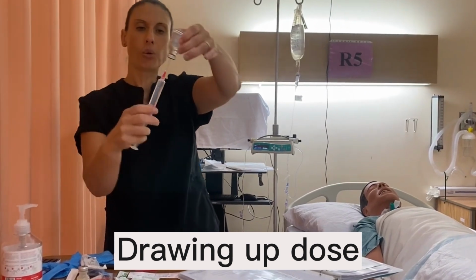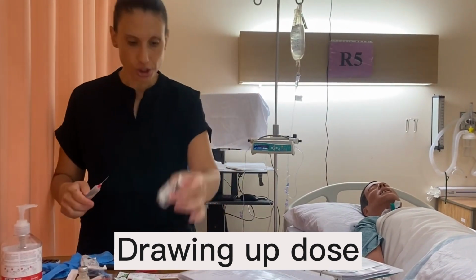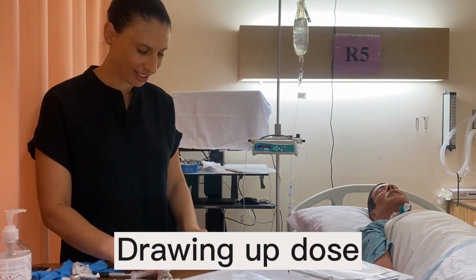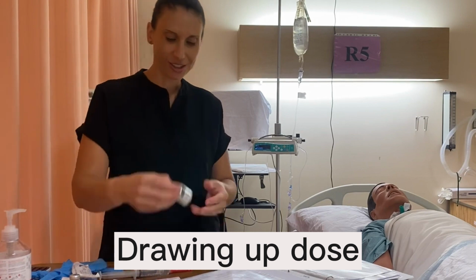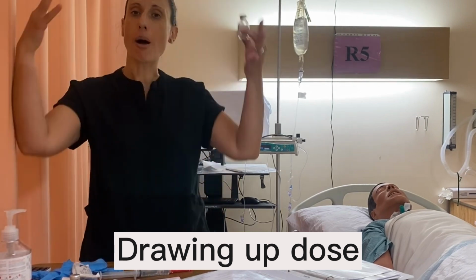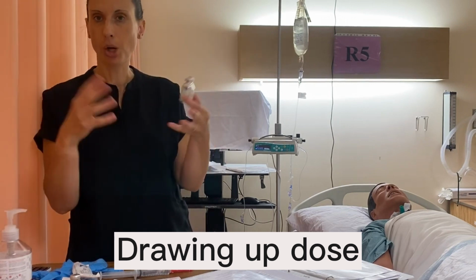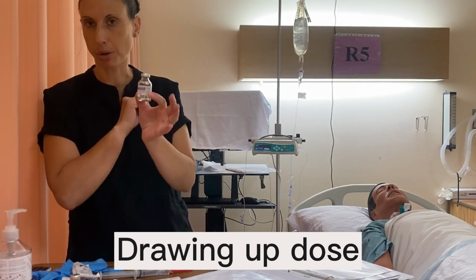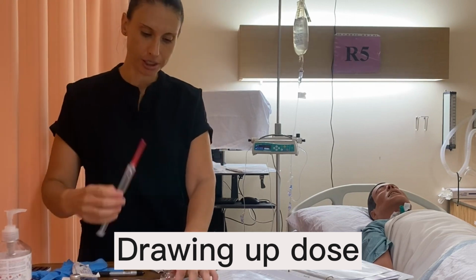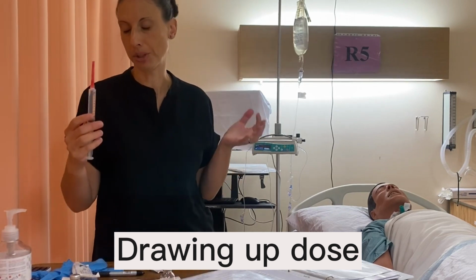Now, one thing about the lab is the medication that is inside here, the powder, is not actually medication. It's a fake powder, okay? It's not like a fake medication. So in clinical, the medication would puff up when it's added with sterile water and normal saline, so then the volume would be greater. In the lab, it doesn't puff up because it's not real medication.